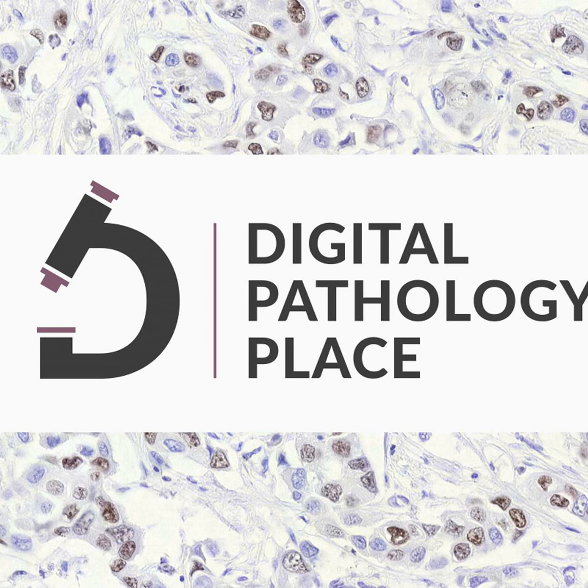So that's an international effort. We have an international group as well. And they say CHIEF outperformed the state-of-the-art deep learning methods by 36.1%, showing its ability to address domain shifts observed in samples from diverse populations and processed by different slide preparation methods.